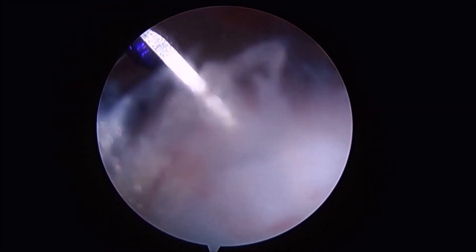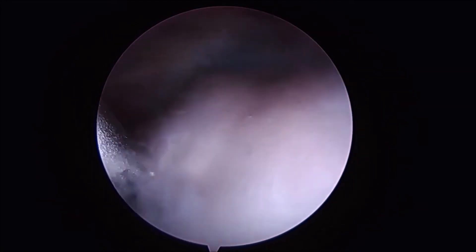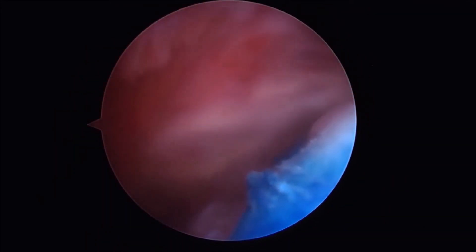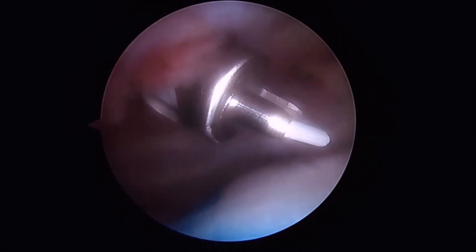As we work medial and lateral we can then secure the graft into place to allow for removal of the insertion guide. Once the graft has been secured along the medial margin we can then allow access to the lateral aspect of the graft along the footprint.